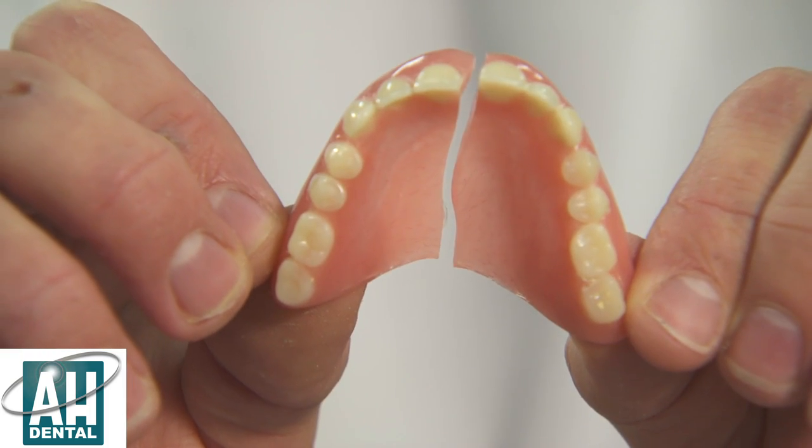Hello, my name is Danny from Allen Hayley Dental Lab. I've been asked by a few patients how we repair our quality dentures, and this is a short video on how we do it.